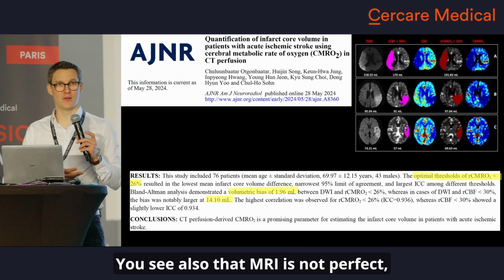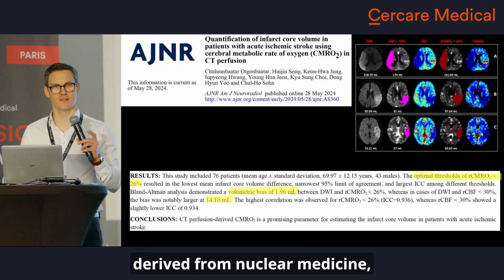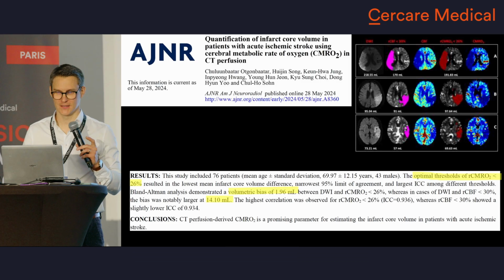You see also that MRI is not perfect, so maybe CMRO₂, which is a very good gold standard derived from nuclear medicine, can be used directly in the angio suite.